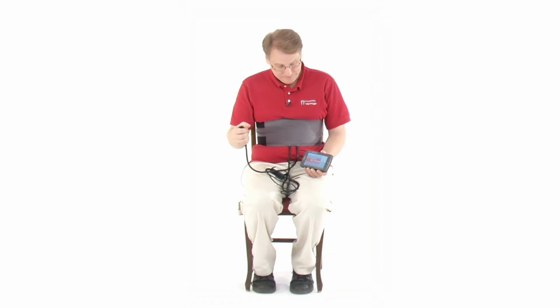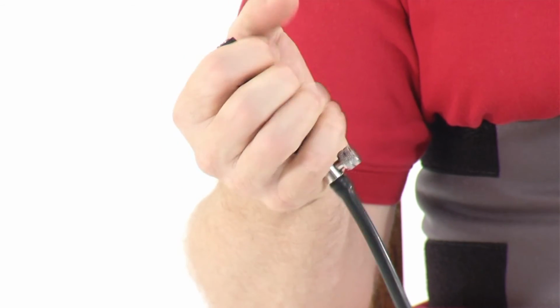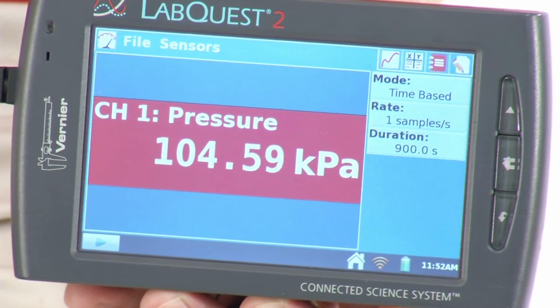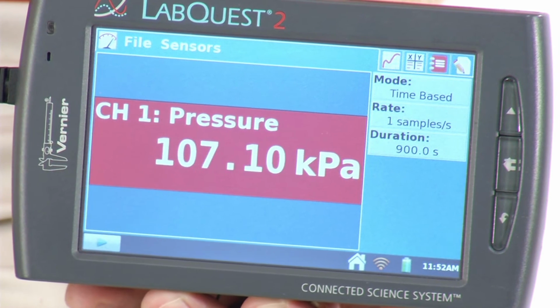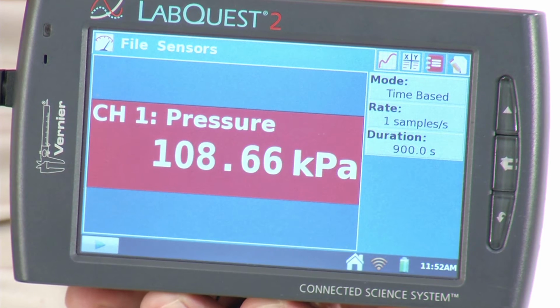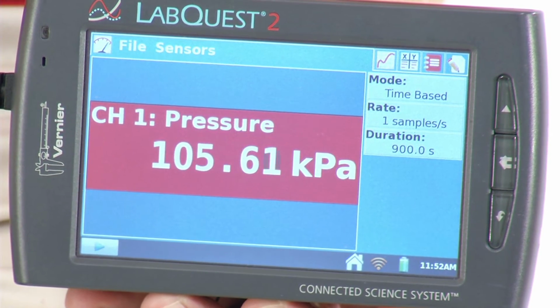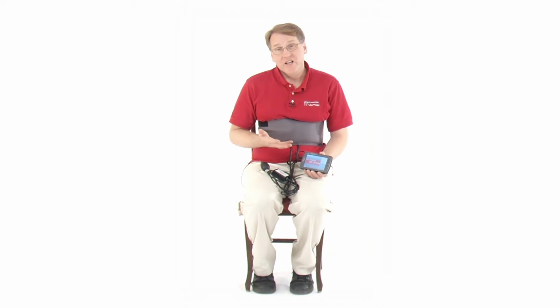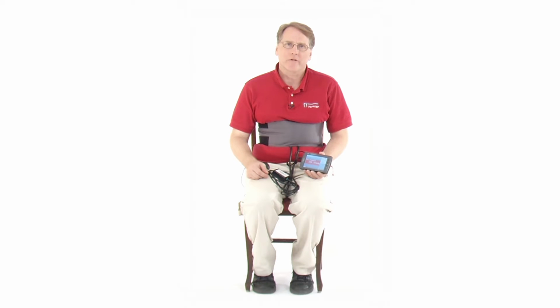So I'll pump this up. Okay. And so now it's a little over 106, so that should be just fine. We'd like to test whether or not the pressure delta is good enough. So if we just look at the screen as I breathe in and out, I can see that the pressure is changing at about 3 kPa as I go up and down. So the cuff pressure should be about right.